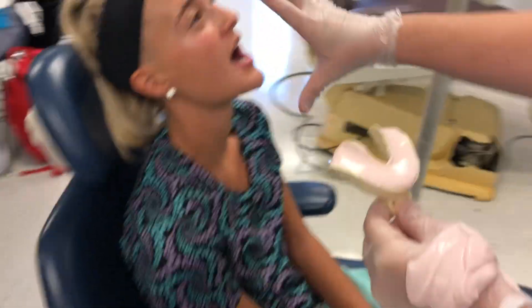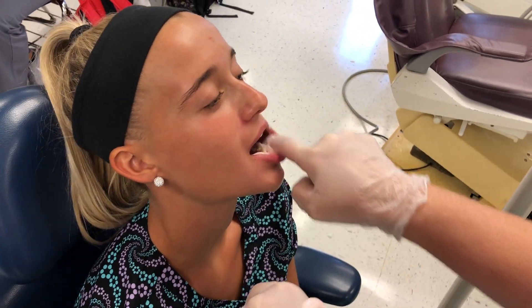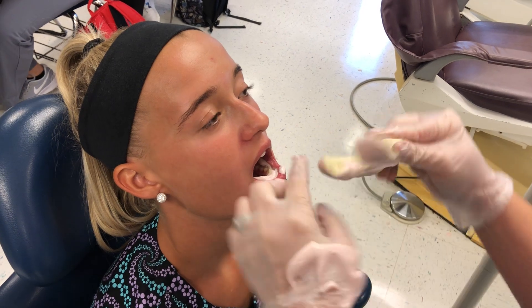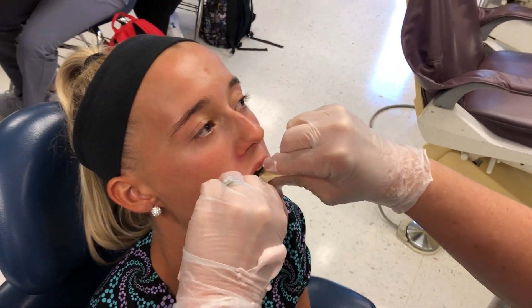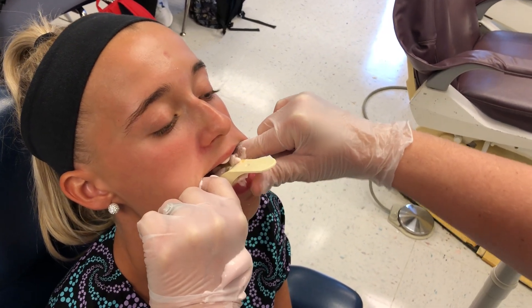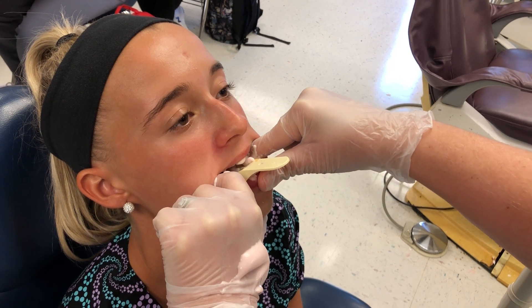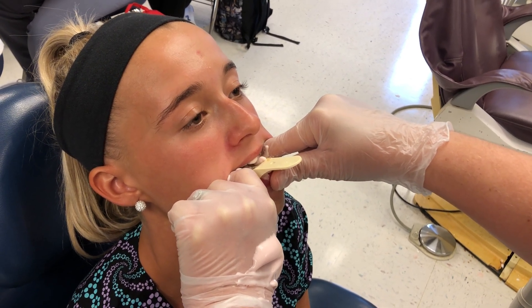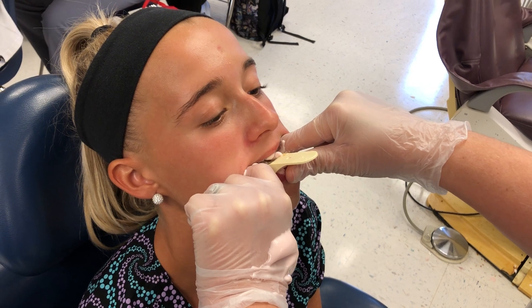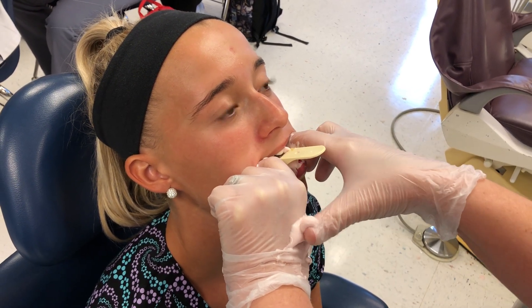I'm gonna put a little bit in the vestibule — relax your lip, open, relax your lip again. I'm gonna seat it in the back, bring it to the front, and hold that lower lip up just like that. Once it sets up on my hand it'll be complete — it's still gooey so it's not ready yet.